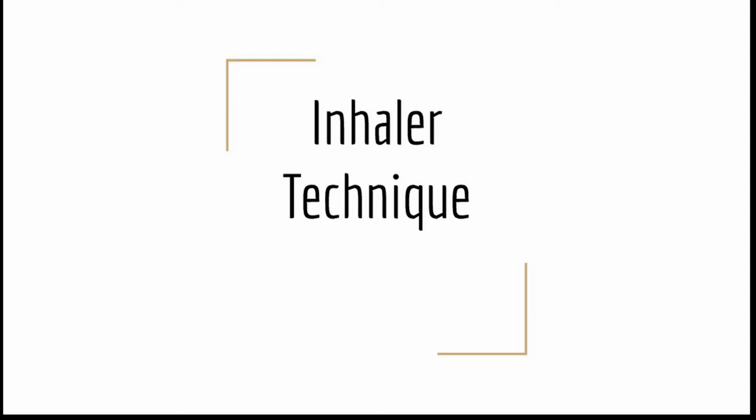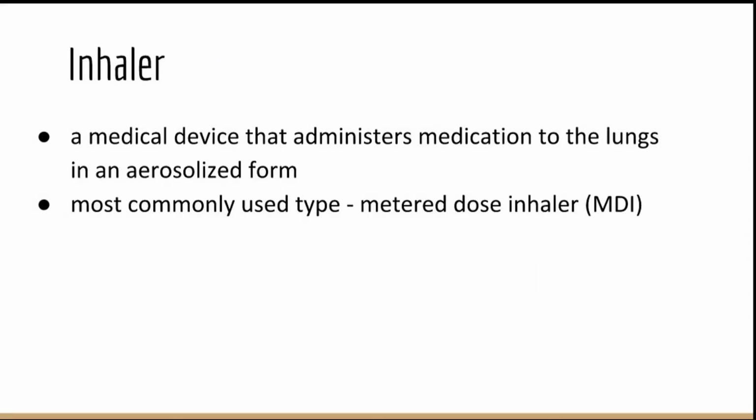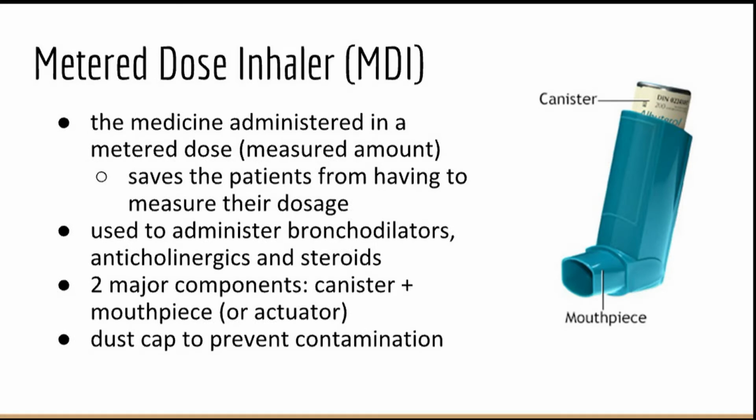Today we'd like to talk about inhaler technique. An inhaler is a medical device that administers medication to the lungs in an aerosolized form. And the most commonly used type of inhaler is the metered dose inhaler, which in short we call an MDI. With an MDI, the medicine is administered in a metered dose, which means in a measured amount. And this saves the patient from having to measure their dosage every time they use it.